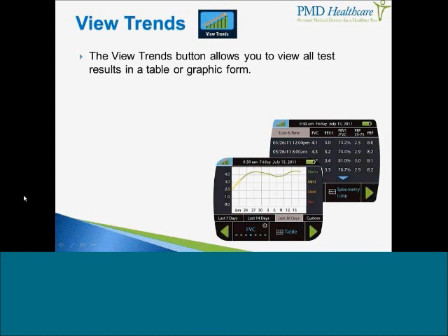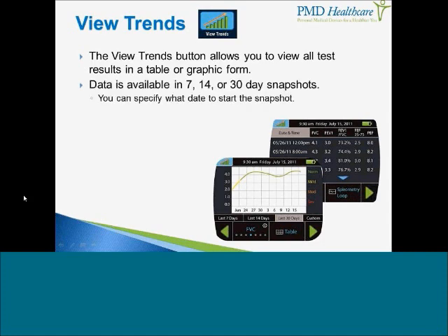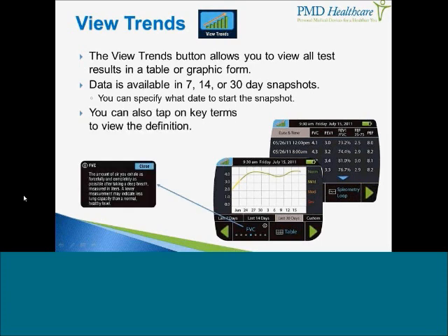The View Trends button allows you to view all test results in a graph or table form. You can view your data over the last 7, 14, or 30-day snapshots, and then specify whatever date you'd like to begin that snapshot. You can also tap on key terms to view the definition — for example, if you forget what FVC means, simply click on the key term and a pop-up will give you the definition.